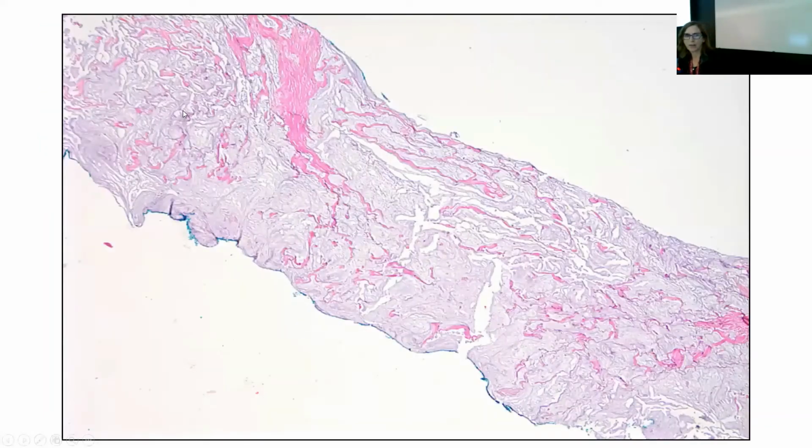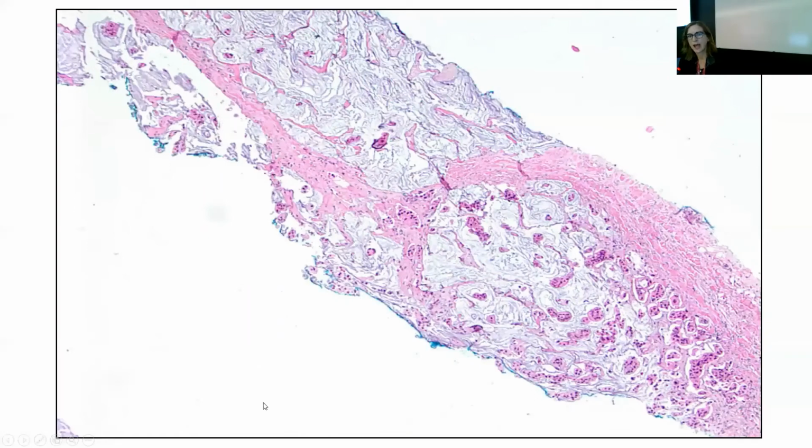So here's a perfect example of a potential pitfall, where you have a core biopsy with stromal pools of mucin, no epithelial elements here. So could this just be stromal mucin, or do we need to worry about mucinous carcinoma? Well, if you have something like this and none of the cores show any epithelial elements, I would advise getting some levels. Indeed, this case did have epithelial elements in a separate core. It didn't require levels, but you can see how you might get a sample in a hypocellular mucinous carcinoma, which just has the pools of mucin and no epithelial elements. That's the potential pitfall.